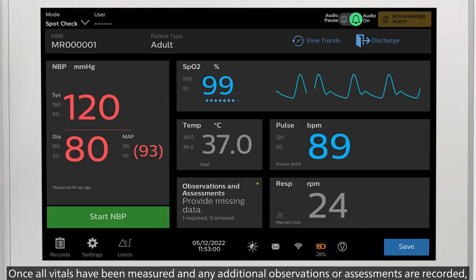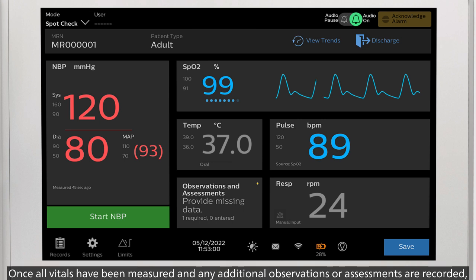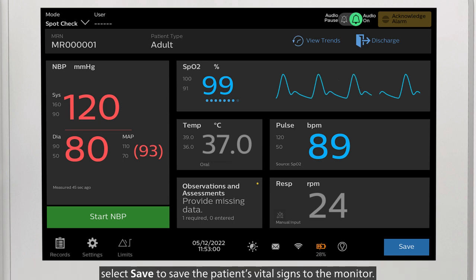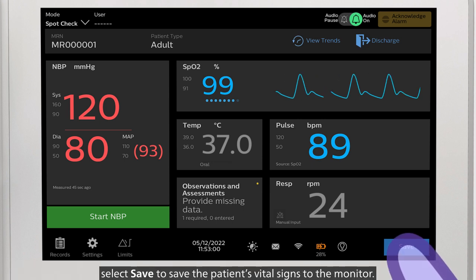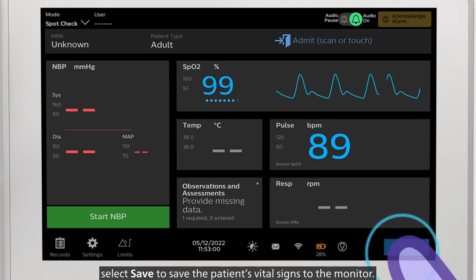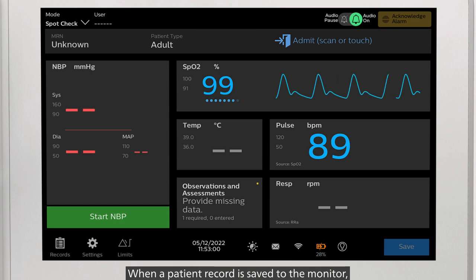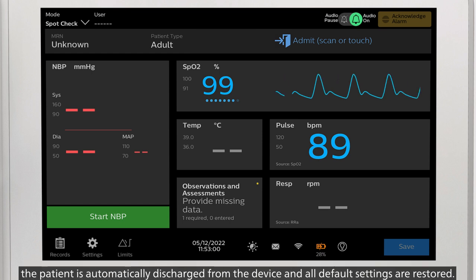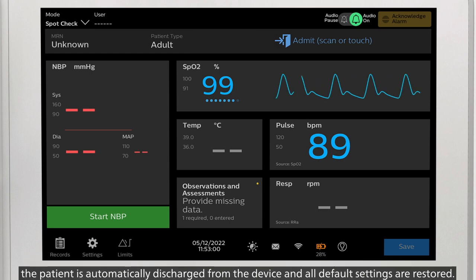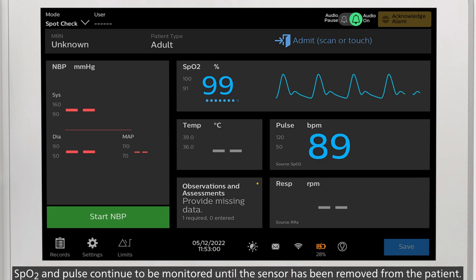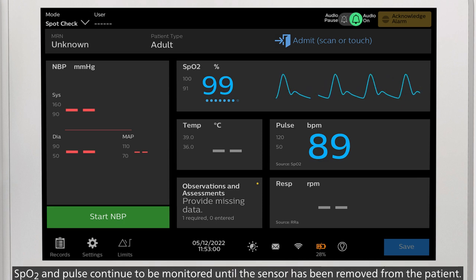Once all vitals have been measured and any additional observations or assessments are recorded, select Save to save the patient's vital signs to the monitor. When a patient record is saved to the monitor, the patient is automatically discharged from the device and all default settings are restored. SpO2 and pulse continue to be monitored until the sensor has been removed from the patient.